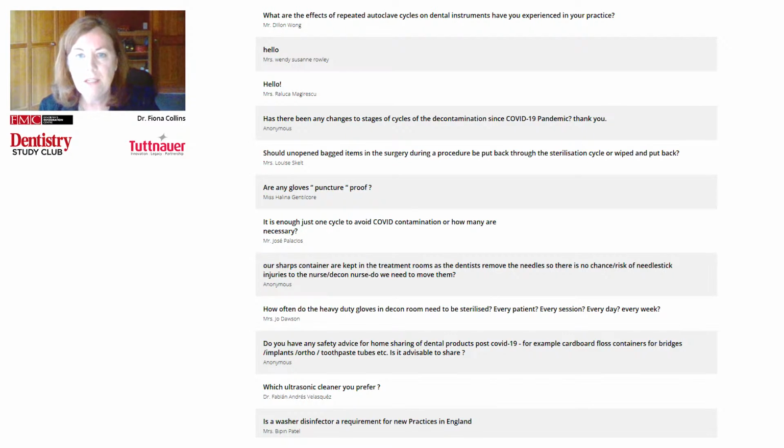Next one's not related. The next one is, which ultrasonic cleaner do you prefer? Honestly, I can't say I have a preference. It's going to depend on the circumstances. You'd really want to look at what you're looking for in an ultrasonic cleaner. Are you wanting one that is built in? Are you wanting a countertop? What volume do you want? How streamlined do you want it to be? What accessories are available? And of course, what support can you get from the company? Those are some of the considerations.